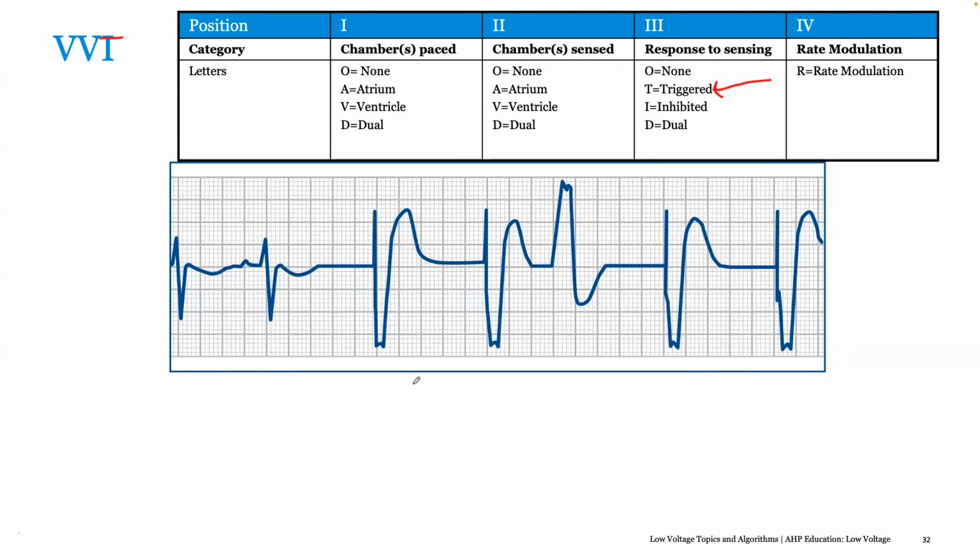And then the fourth one for us, and again, I'm not sure if you have the luxury, but for this particular group of patients, we would actually ablate the AV node. Now, I know you may not have that luxury. Yes, we don't have that luxury here. Okay, fine. Very important. So I think in this candidate of patients it's just a matter of programming VVI, turning on V-sense response, trying to up-titrate their beta blocker as much as you can, and seeing how you go with that.